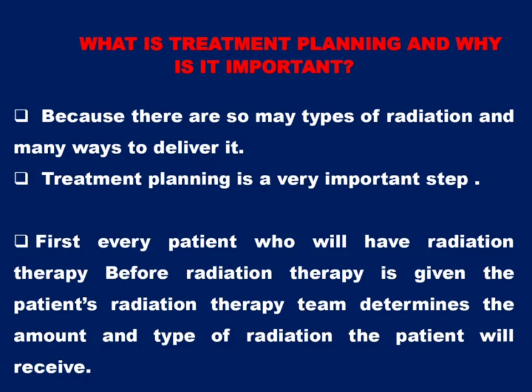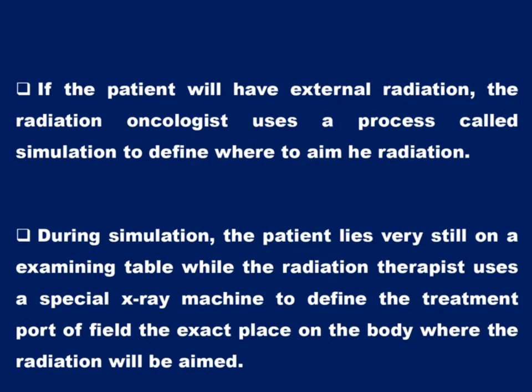The steps we do for getting a CT scan: CT simulation is done, and then after CT simulation, the slices are transferred by the DICOM method to the treatment planning system, where we contour the tumor slice by slice. Suppose 5 slices have a tumor, and the cuts are 1 centimeter. That's a tumor size of 5 centimeters. If you add a margin of 1 centimeter up and down, you can cover the 7 centimeter field.